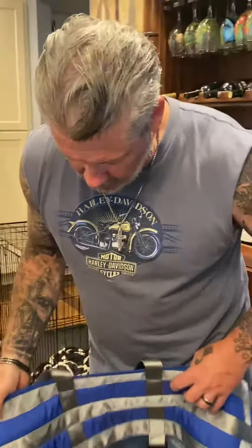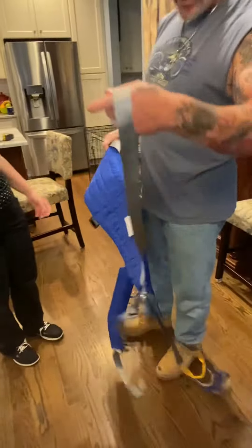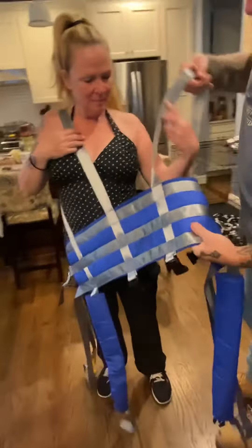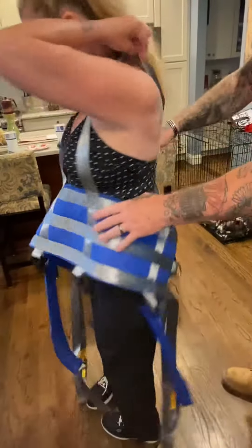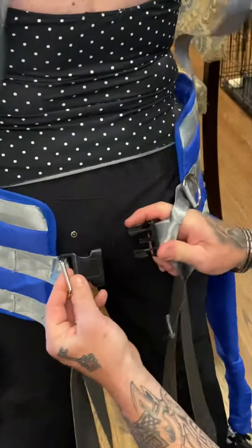This is the front of the brace. These straps go over the shoulder. Turn around. This snaps into here.